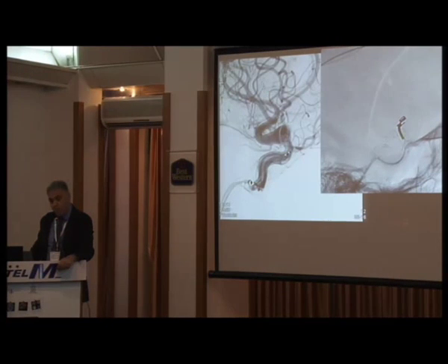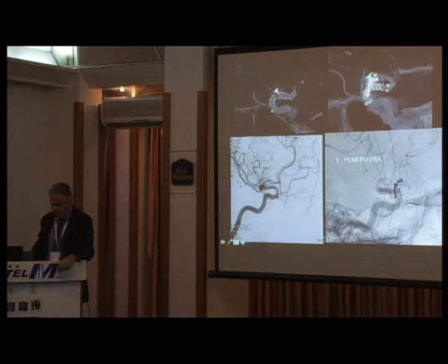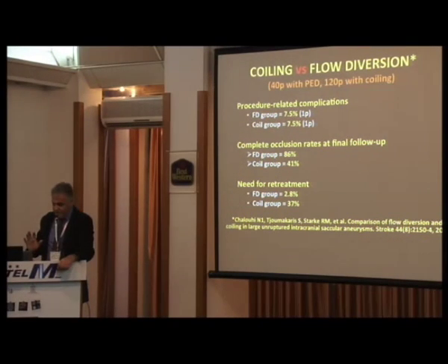So in those years, we had good flow diverters for better healing reactions and better hemodynamic treatment. And this is the flow diverter. And this is the combination of clip, flow diverter and aneurysm. And this is the 1 year follow-up of these vessels. And we now have 7 year follow-ups of these modern flow diverter options. Still we are in good shape. And when you start to look at the coiling and flow diverter groups, the retreatment rate is reduced down to 3%.